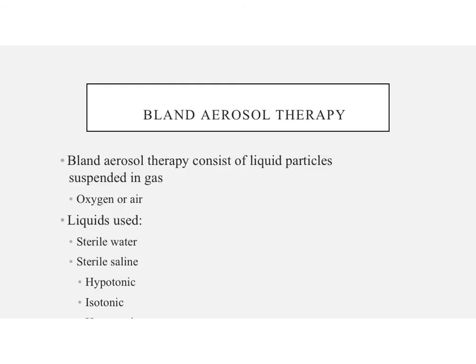Now we're going to move on to other therapies that are done with humidity for specific indications. Bland aerosol therapy is a type of humidity where it's not water vapor, it consists of liquid particles that are suspended in a gas.